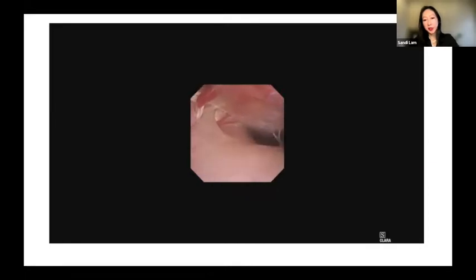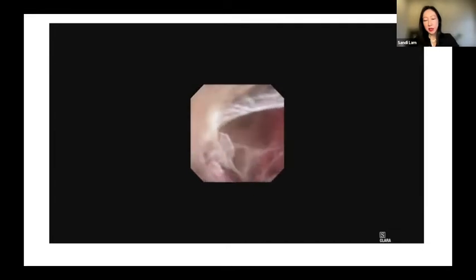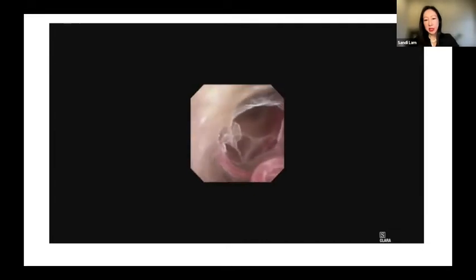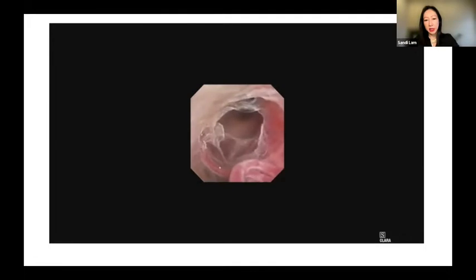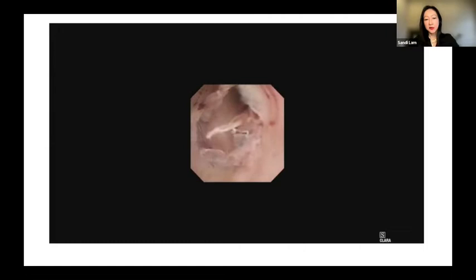That's the vertebral artery there. And so we're really quite deep into the prepontine cistern here. But that really gives the best chance for cerebral spinal fluid flow. And then as we withdraw the endoscope, you'll see a really great CSF pathway, good pulsations. That is the floor of the third ventricle.